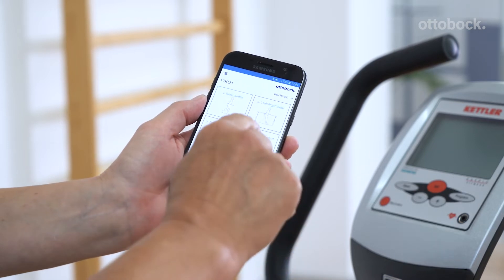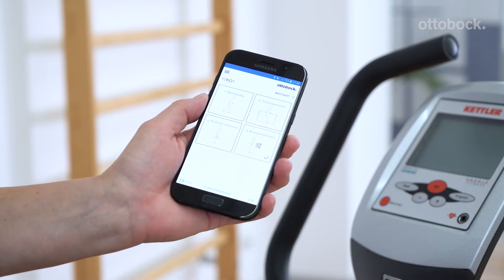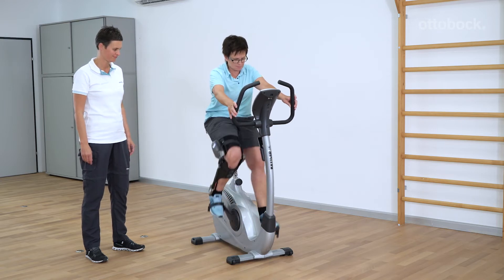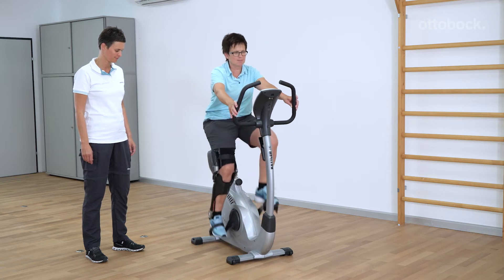The behavior of the C-Brace can be adapted according to the situation. Patients can do this by selecting one of four My Modes and activating it via the Cockpit app. The My Mode defined by the user can be individually adapted by the O&P professional.